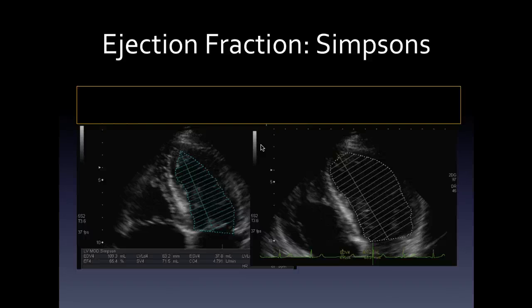It's sometimes hard to get a good apical 4-chamber and an apical 2-chamber view. And certainly that's the view, for me personally, I find the hardest to get actually. I find a good apical 4-chamber can be my hardest one to get. The other thing about it is that the near field is very difficult in an ultrasound. The near field is obviously where the ultrasound probe is emitted from, and this is the area that is often where the edge definition is at its poorest.